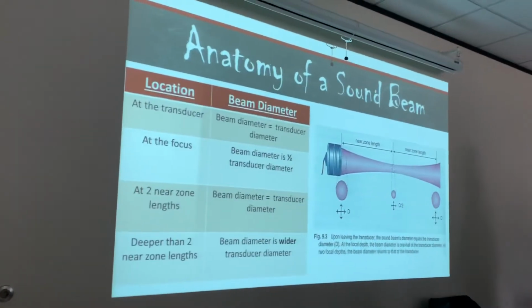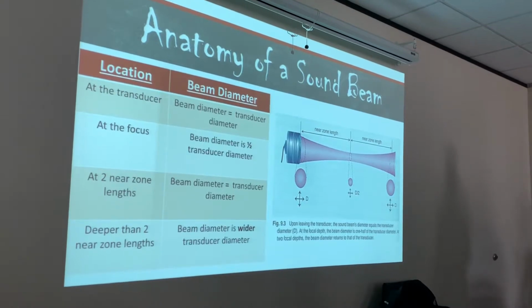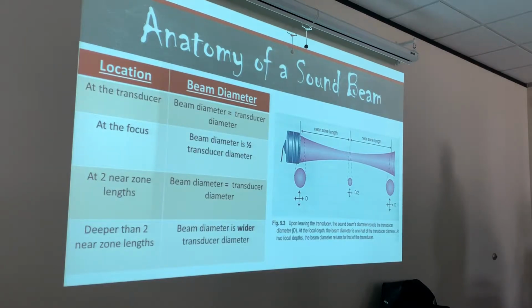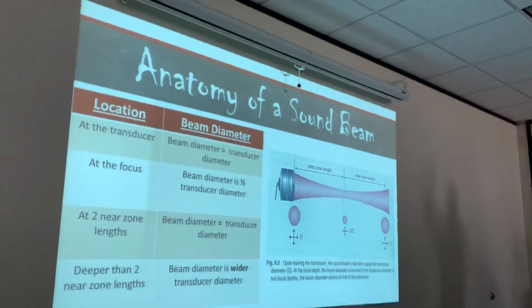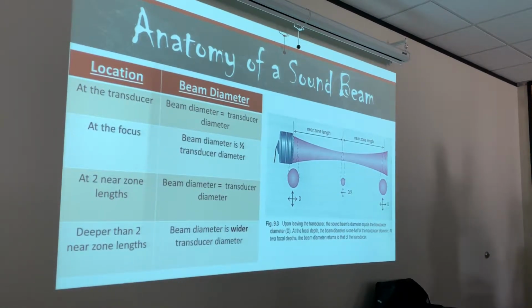So is that still considered far zone? Definitely. As the beam propagates, everything past the focus is considered the far zone, no matter how far it travels, because the beam can get huge. It can be way bigger than the transducer diameter.